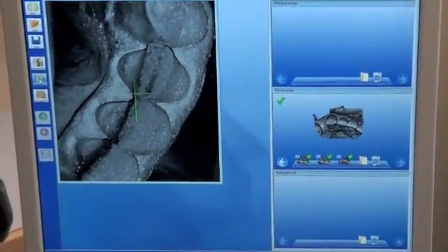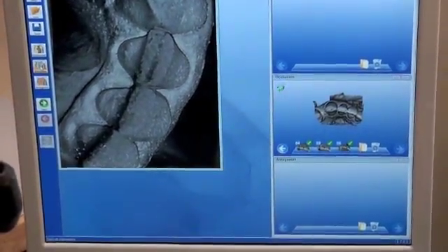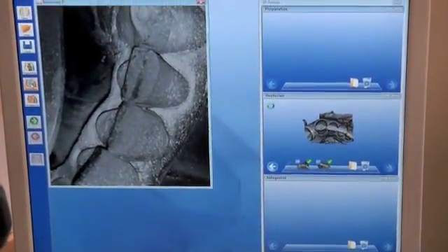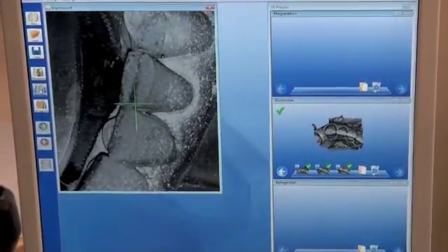Notice that multiple images were taken from multiple angles to ensure that the entire contour and shape of the tooth could be drawn into the computer. This was to ensure that the final result would be an exact copy of the rough draft.